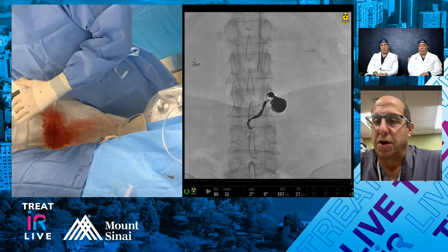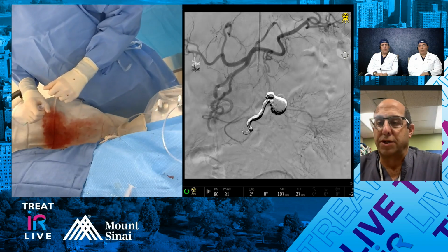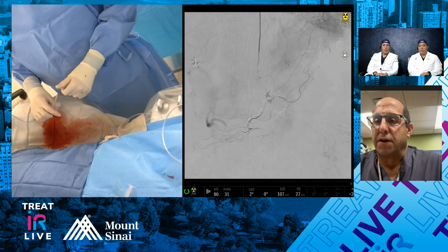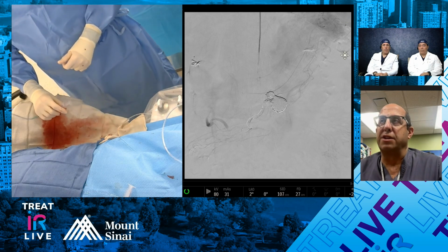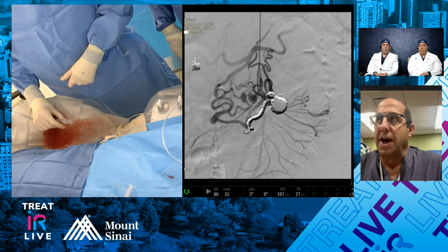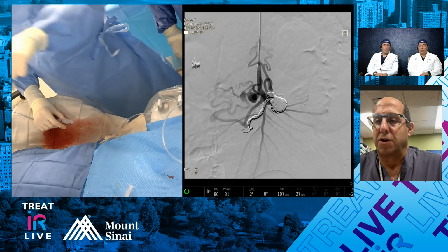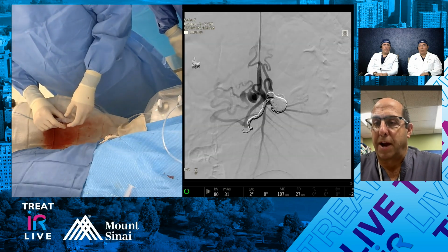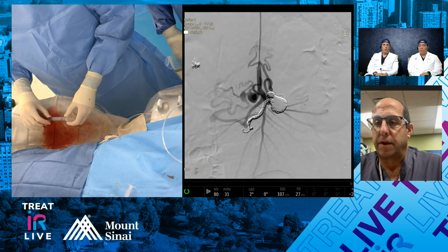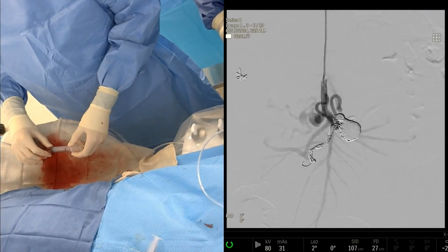There's a little part of me that wonders, could you have put a distal coil as a backstop and then filled that space? You're dancing around a 25% packing density target roughly, and less than 2 ml would give you close to 100% packing density. So does that enter into your thinking about how you approach these cases? It does now, because it wasn't really an option beforehand.